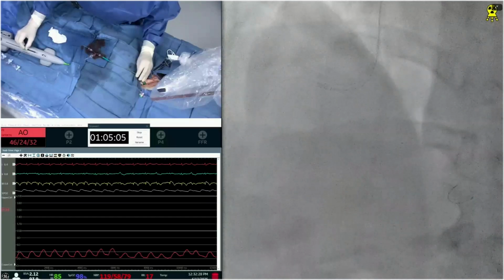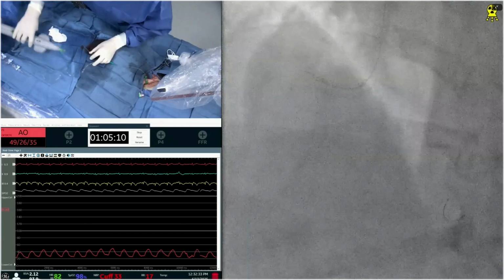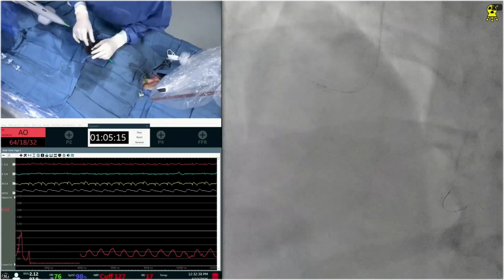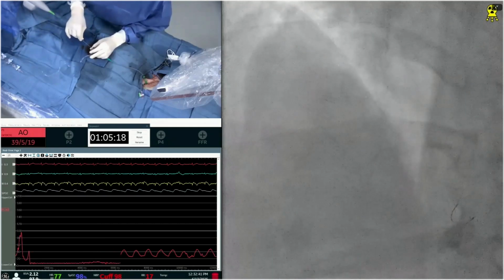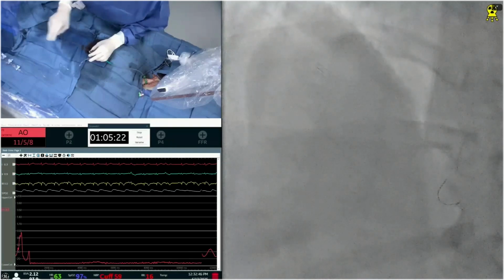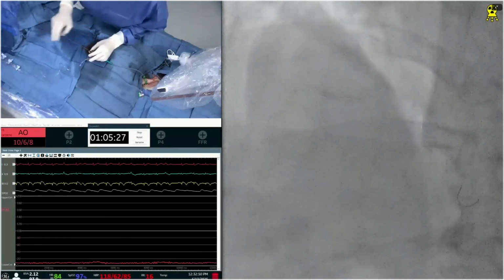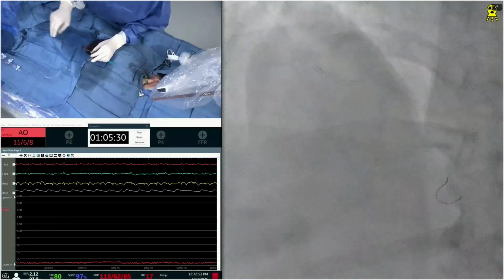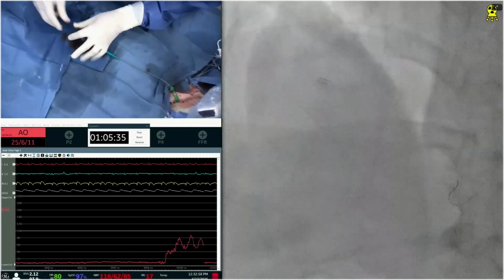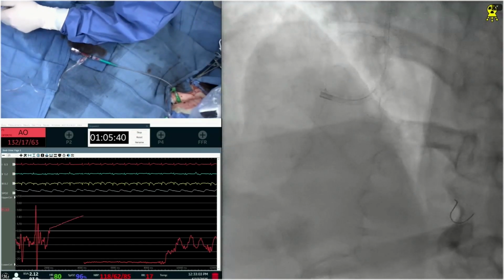RotaPro, yep. Okay. And not only that, the next is that we are getting the burr. I just went to their plant, the complete burr, that means on both surfaces, distal and proximal. So that we tested, the problem came out, the 1.25 burr still gets stuck. So we need to work a little more on it, but the whole issue about burr entrapment, which a lot of people are worried about with rotational atherectomy, hopefully will not happen with the new design, but that's a little far away. Until now, we do the same.